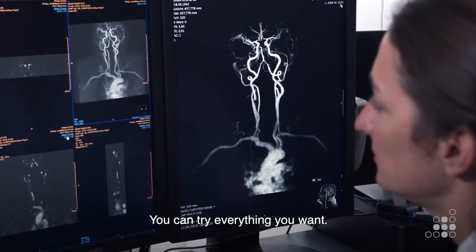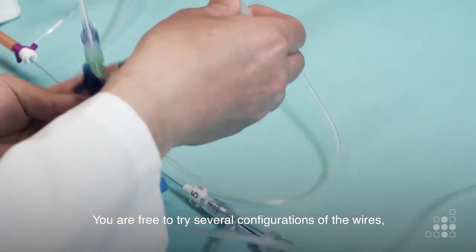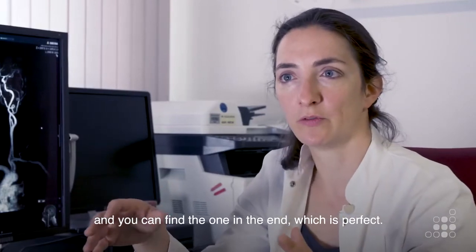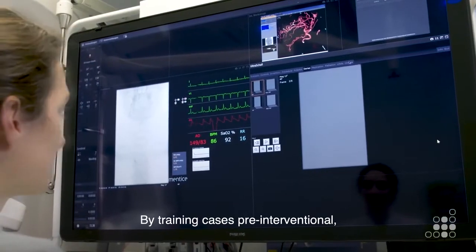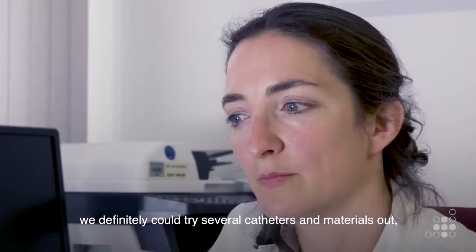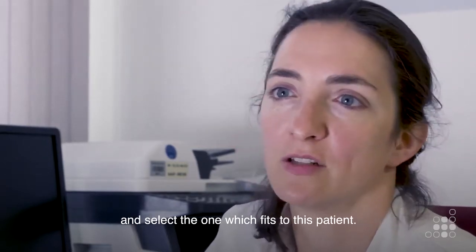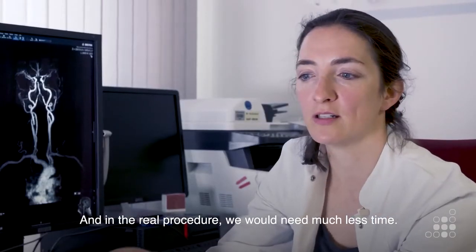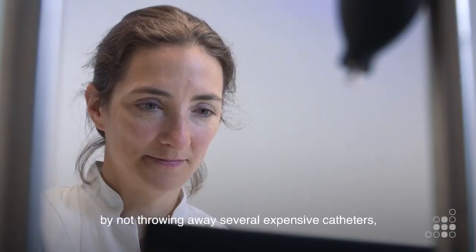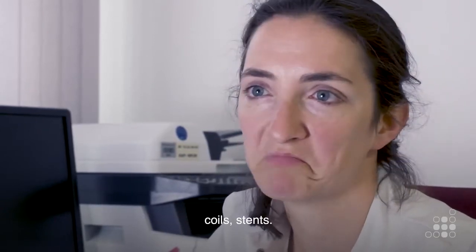You can try everything you want. You are free to try several configurations of the wires, and you can find the one in the end which is perfect. By training cases pre-interventionally, we definitely could try several catheters and materials out and select the one which fits this patient. And in the real procedure, we would need much less time. We would definitely save a lot of money by not throwing away several expensive catheters, coils, and stents.